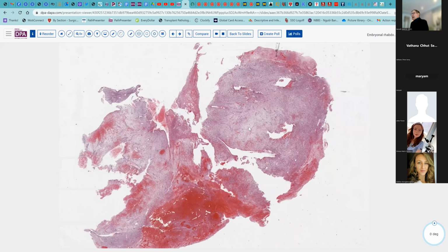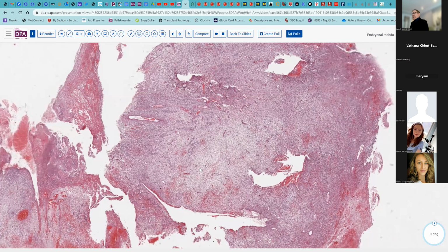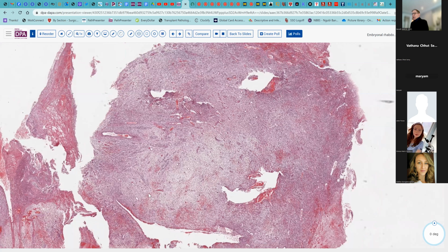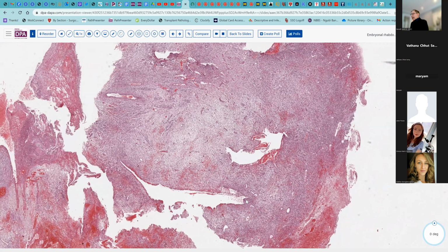And this is an example of the so-called botryoid rhabdomyosarcoma. And so the gross appearance will be fairly characteristic. But what you'll see with this, of course, is some intact surface epithelium, maybe a few glands or vessels, and this very busy and hemorrhagic, poor vascular integrity in these lesions.